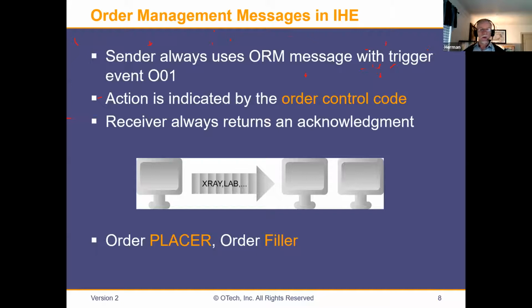So okay, that was patient registration. Now what we're really looking for is an order, because remember the patient registration messages, you don't necessarily see a lot in the PACS, except for the fact that maybe a patient arrival. That will be the only thing that you're looking for. Typically, I don't care so much about patient registration. What I typically worry about is the radiology orders, right? Or cardiology orders, or imaging orders, right? Anything that has to do with imaging.